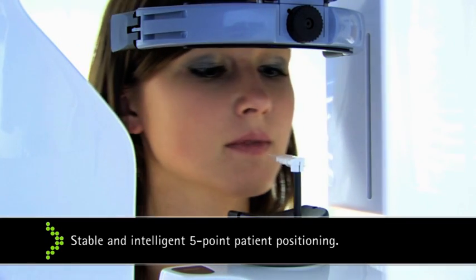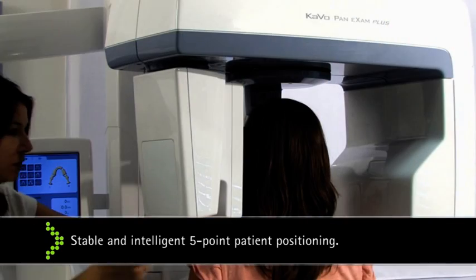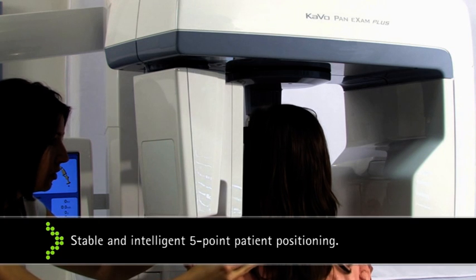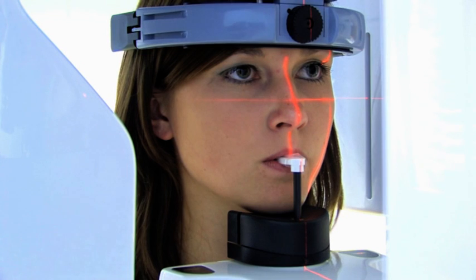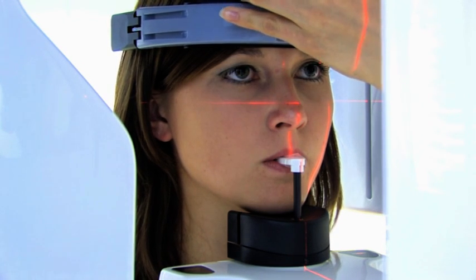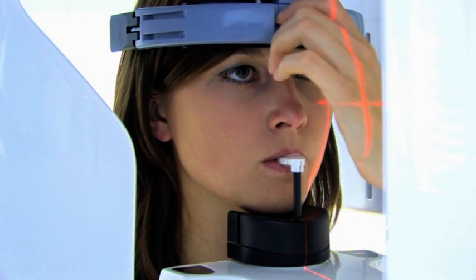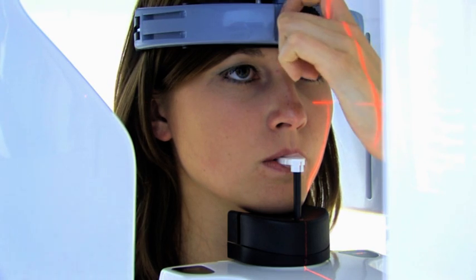The five-point positioning system ensures completely reliable images. Headrest, chinrest, and bite block avoid artifacts due to movement. Four laser visors make exact positioning easier for you.